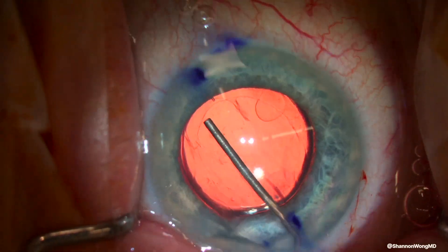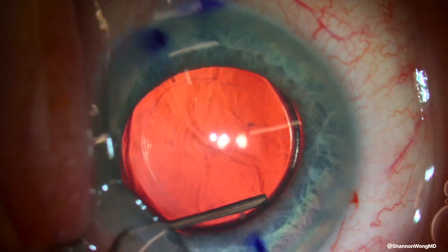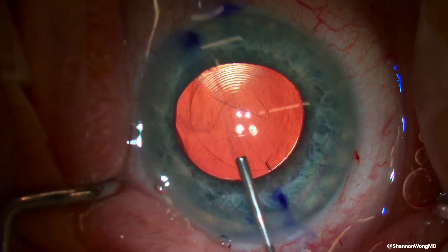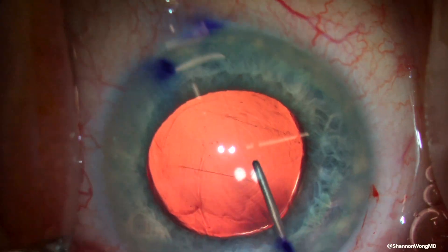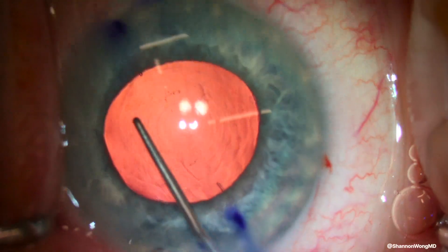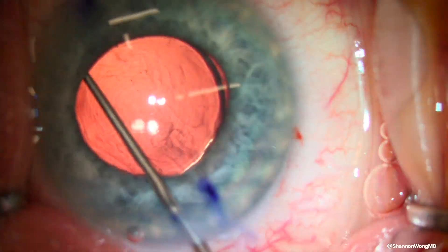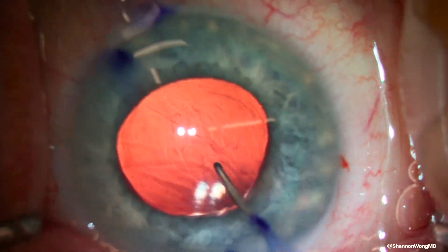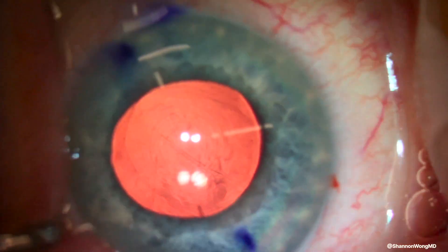Therefore, we place viscoelastic between the lens capsule and the implant to create space around the lens haptics, and again use the Sinski hook to rotate the lens clockwise about 19 degrees. Once we feel that the alignment marks of the NV multifocal lens are in the correct orientation, we then remove the viscoelastic with our irrigation and aspiration handpiece.